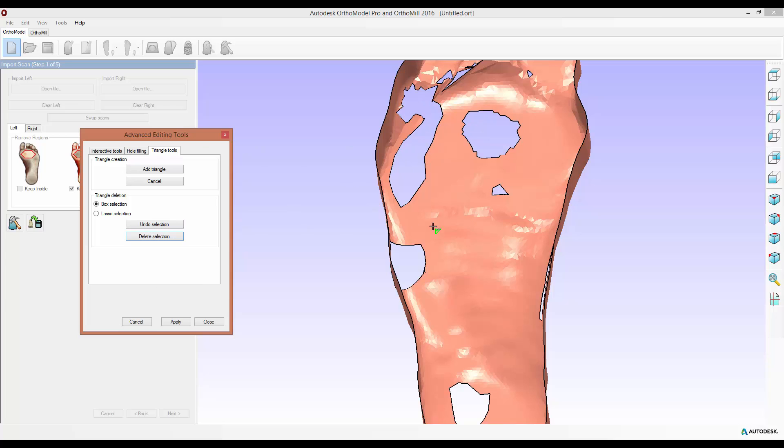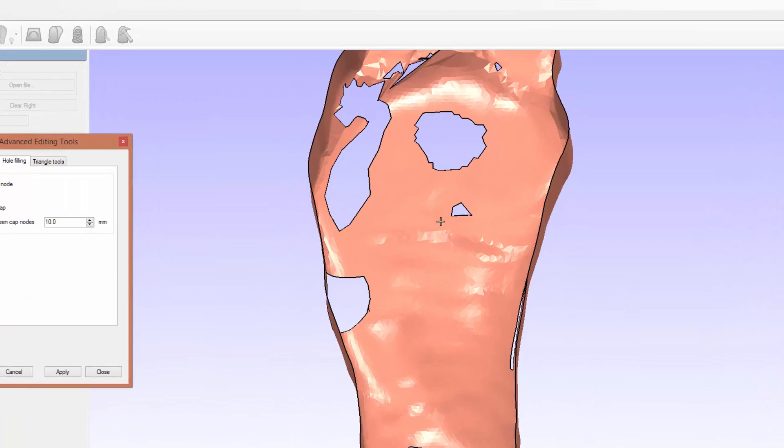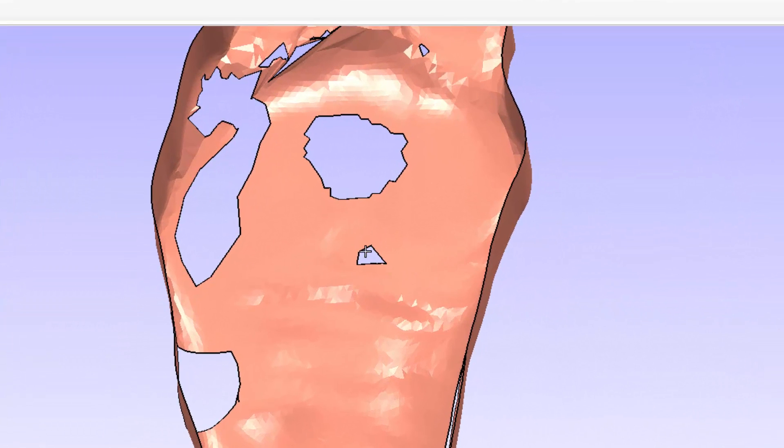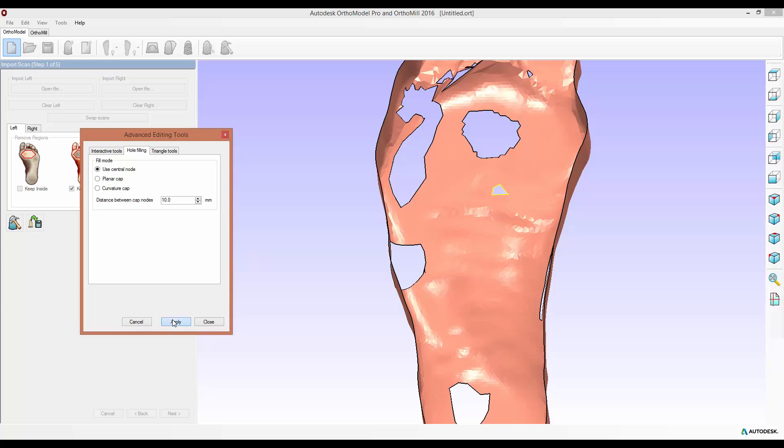I've also got numerous holes within my scan data and the hole filling tab allows me to deal with these. There's three modes of doing so. Use central node will pick a point within the center of the hole boundary and create triangles from that point to the boundary edge. This is the fastest method but it's probably the least precise. It's useful to use on holes such as this one which are small, simply select the boundary, it'll highlight yellow and then select apply to apply the fill.